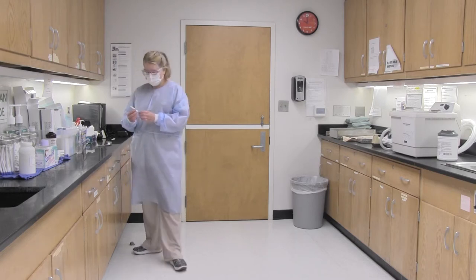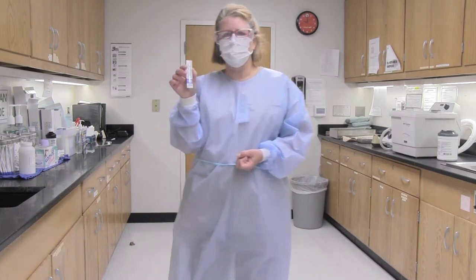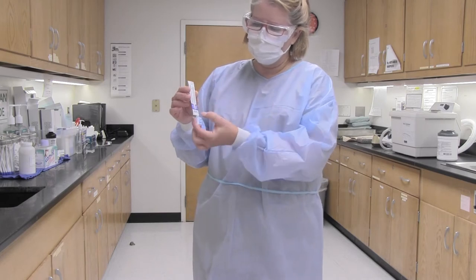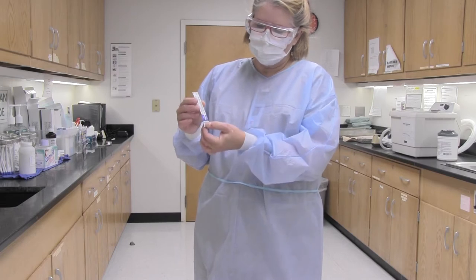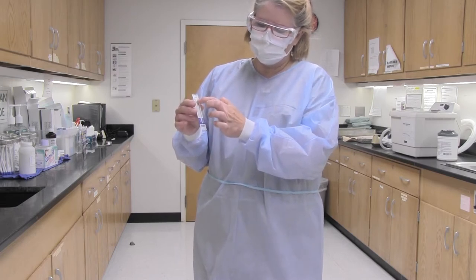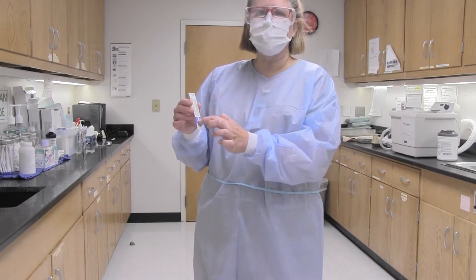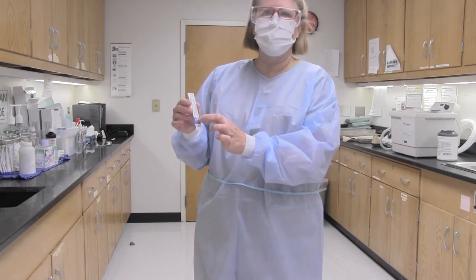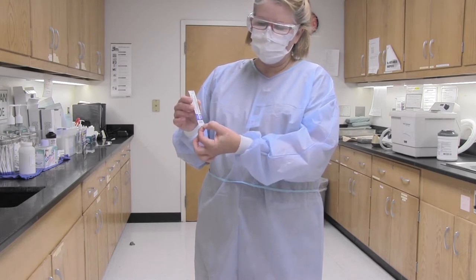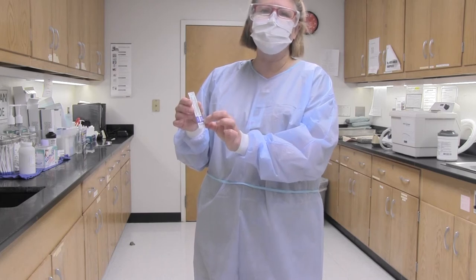I am going to prepare the integrator strip. This is what your integrator strip looks like — it has a little window and a little blue portion that says 'steam safe.' There is a blue line that will start here, and when the load has been processed properly, the blue line will continue. We need the blue line to be in the safe zone, so you want to make sure when you put that into the bag that you can readily see it when you open the autoclave.